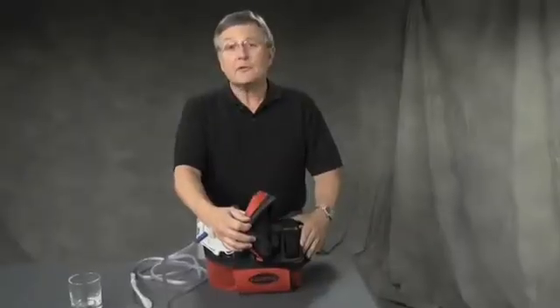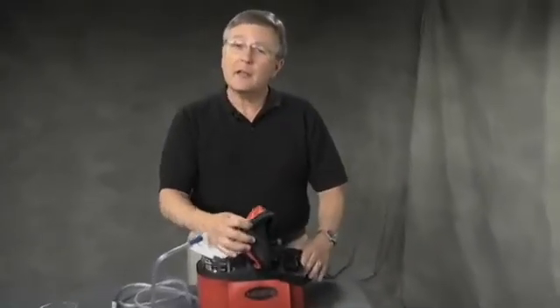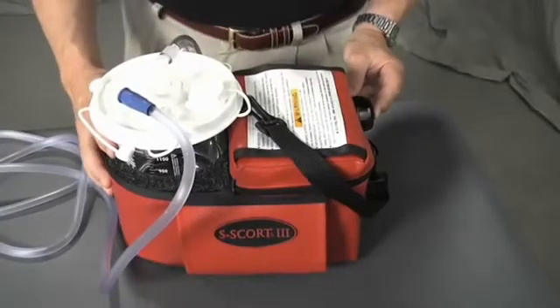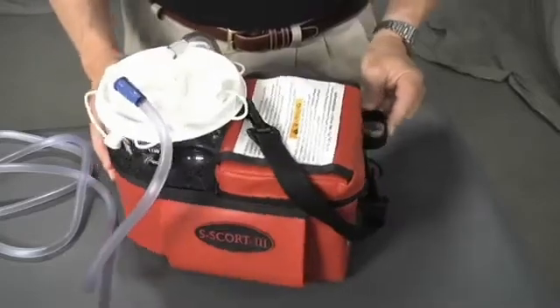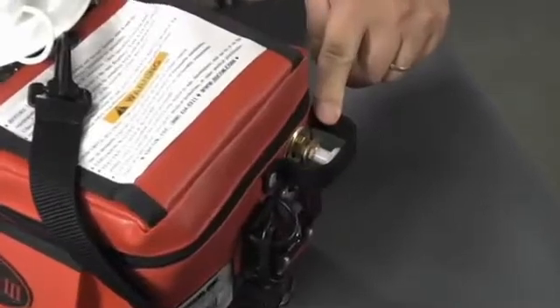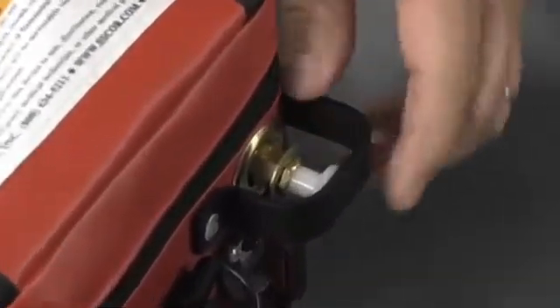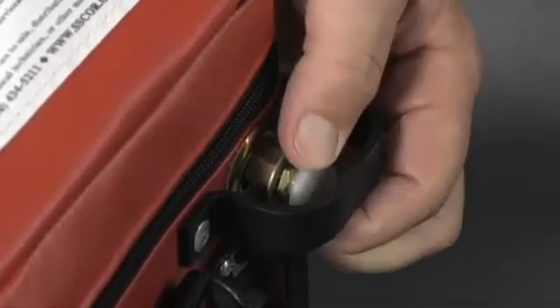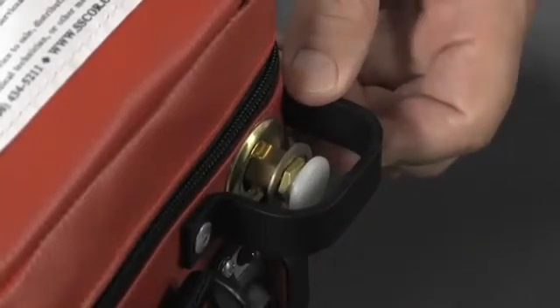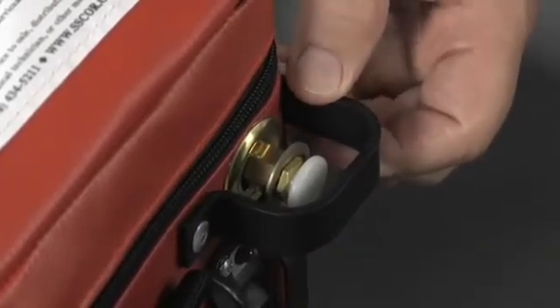Ease of use is important. Field medics cannot choose the environment in which they offer care, and lighting is never optimal. The Escort 3 has a two-position regulator which provides, at the push or pull of a button, one of two essential vacuum settings for field suction. Push the button in and the Escort 3 is at full power — more than 525 millimeters of mercury — for oropharyngeal suctioning.